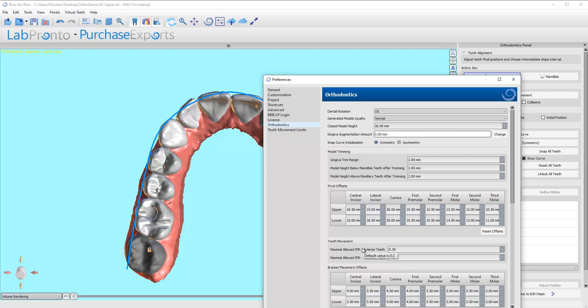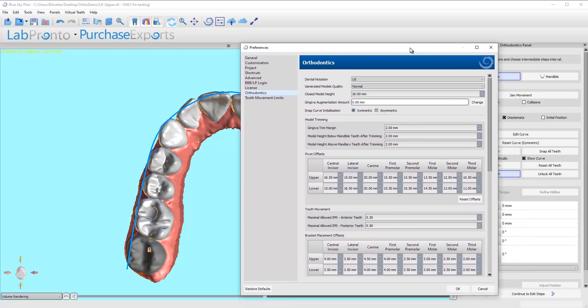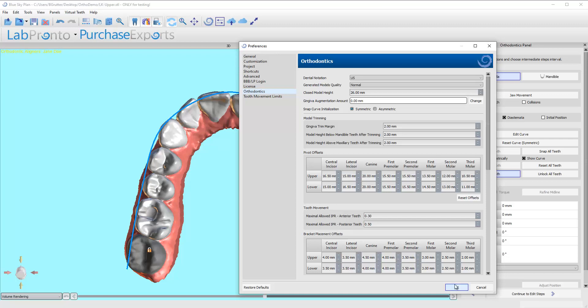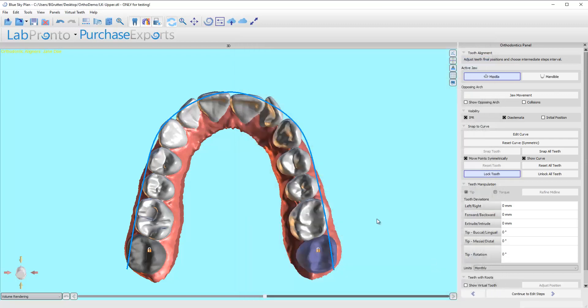This is going to try to limit anterior IPR to 0.3 and posterior IPR to 0.5 millimeters. You can dial it down to zero if you want—the software will override that but it will warn you if it has to. It's like, press okay, but just be aware we're exceeding the maximum allowable.